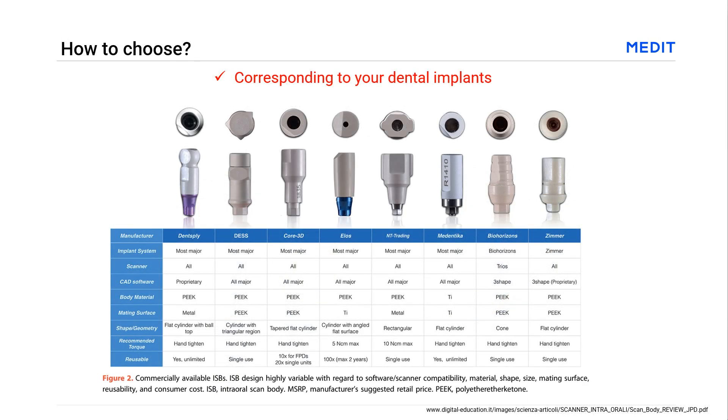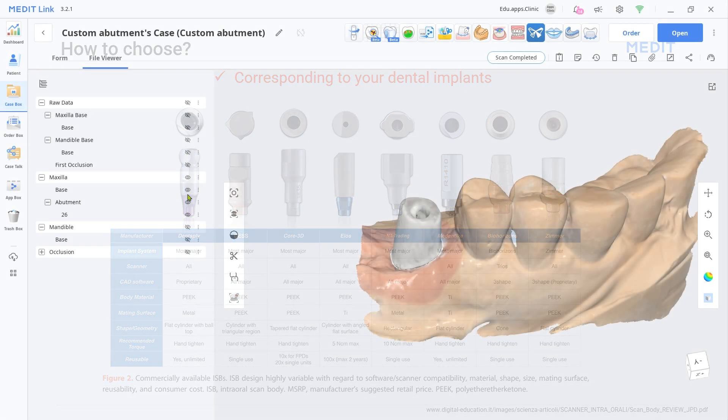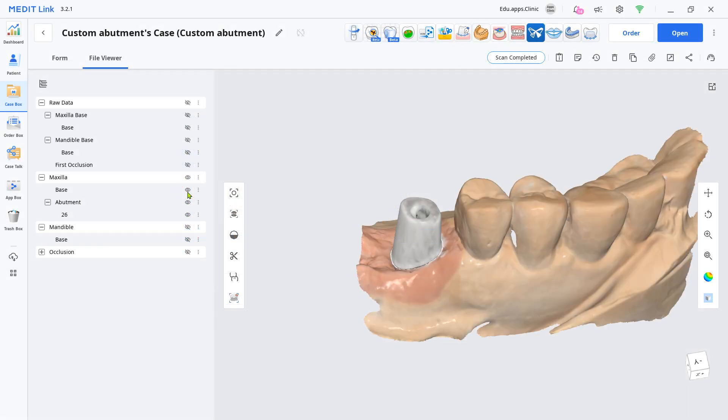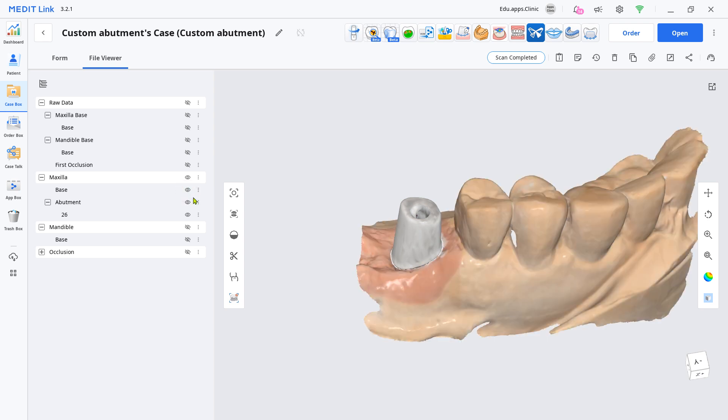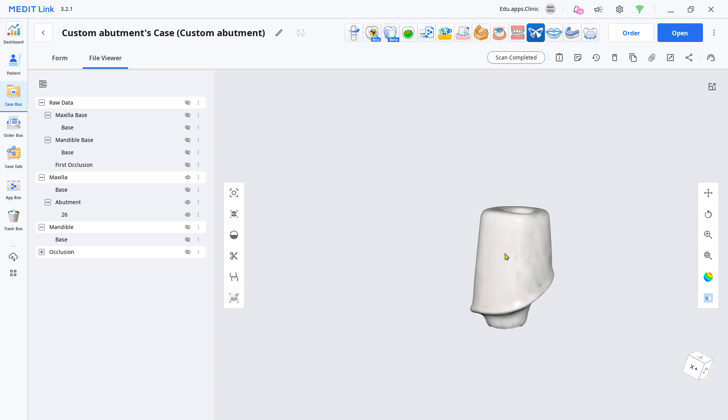Normally, you would use the scan body to deliver the exact location and angulation of implant, but if the margin is either equal or subgingival, then you can create your own custom abutment library in MeditLink and send it to your lab after matching. Please note that the plaster model has been used as an example for this demonstration.